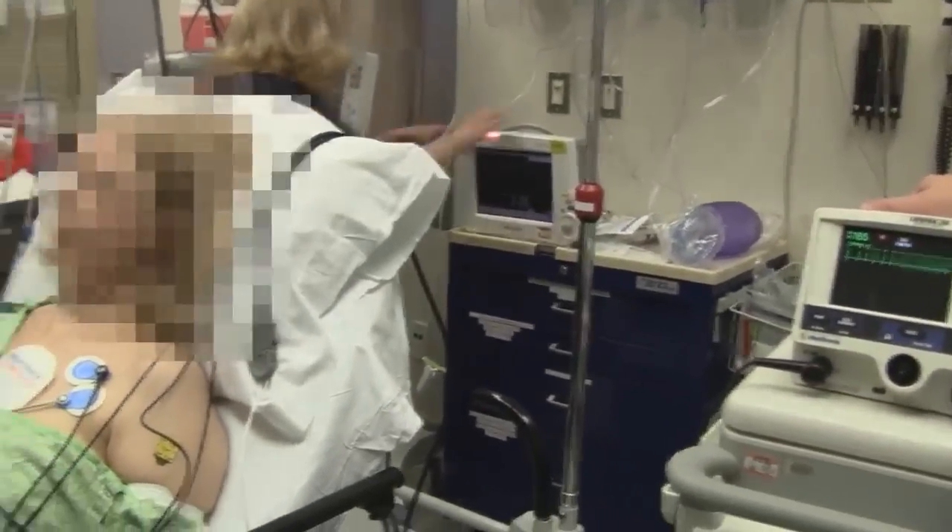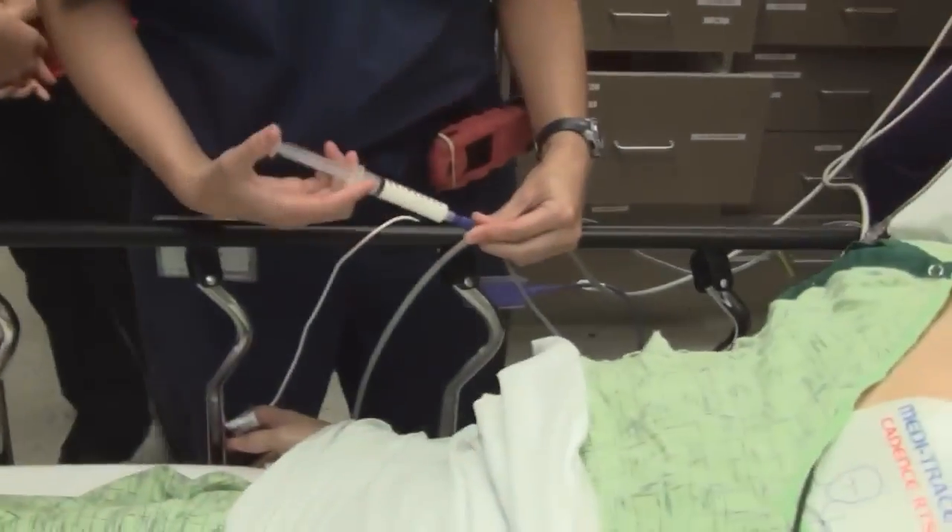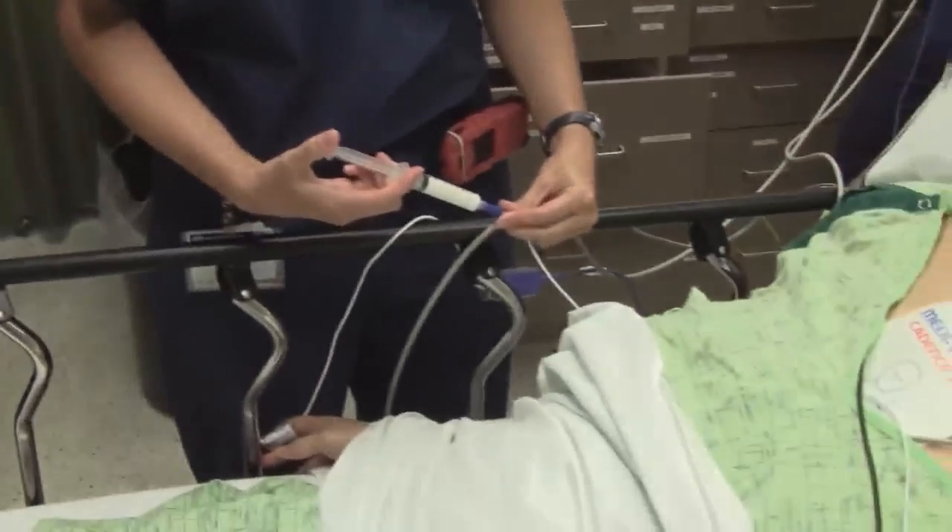Suction's ready. Airway equipment's all ready. End-tidal CO2 is on. All right, here we go — it's game time. Sleeping time.